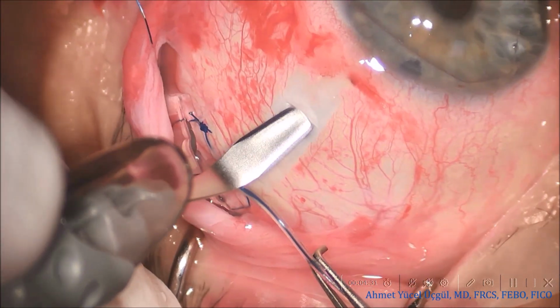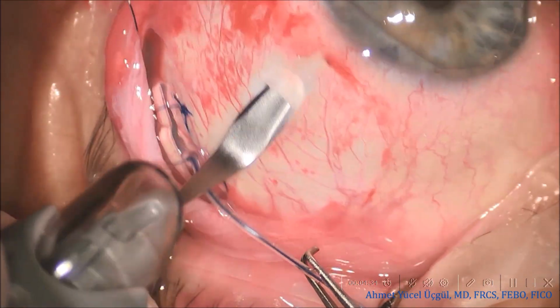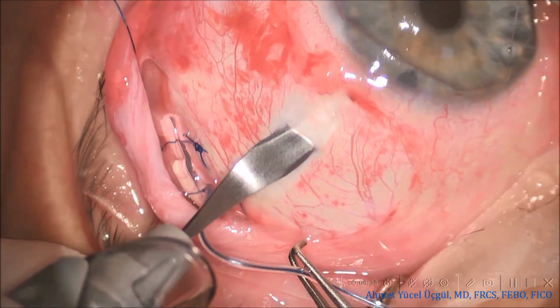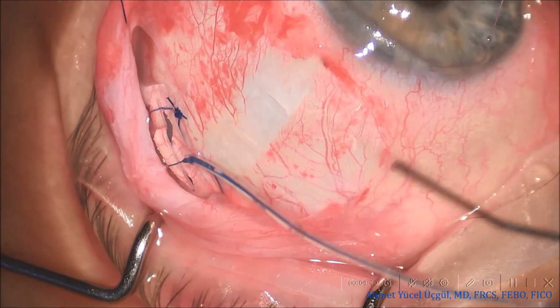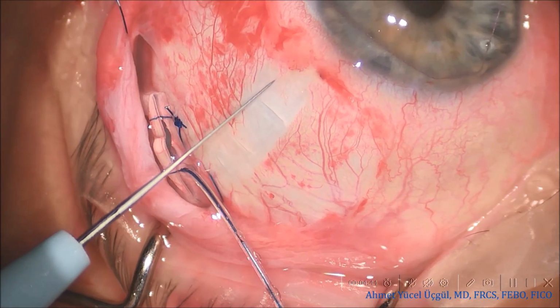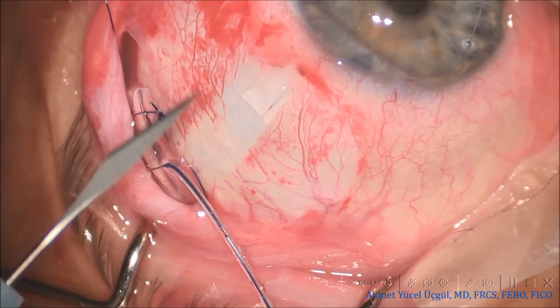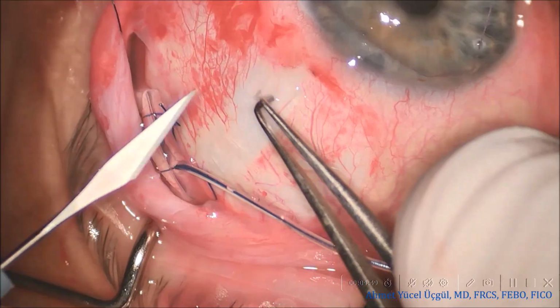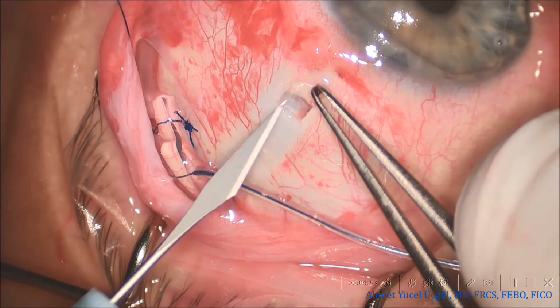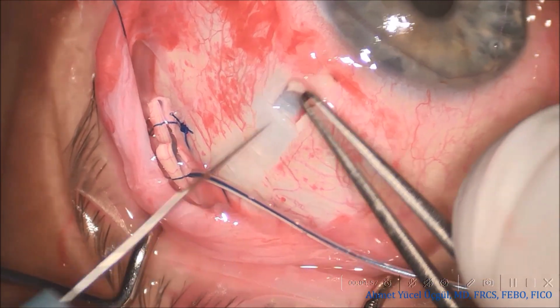This scleral flap differs from the flaps used in trabeculectomy or deep sclerectomy in several important ways. First, it is fashioned at approximately 80% scleral thickness. I consider this thickness important to provide adequate long-term coverage over the tube and to reduce the risk of post-operative scleral erosion. Second, the flap is not extended all the way to the limbus. Instead, it is stopped about 2 millimeters posterior to the limbus, leaving this anterior segment intact for subsequent tunnel creation with a 26-gauge insulin needle.